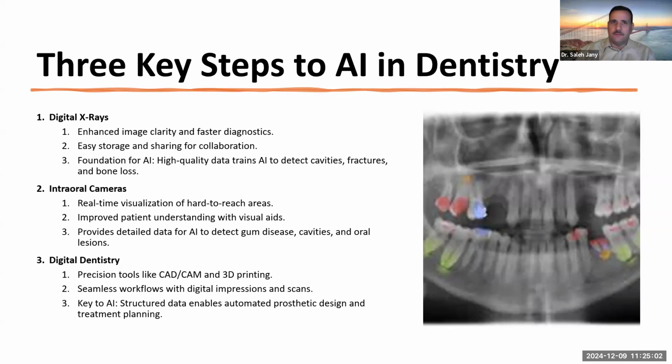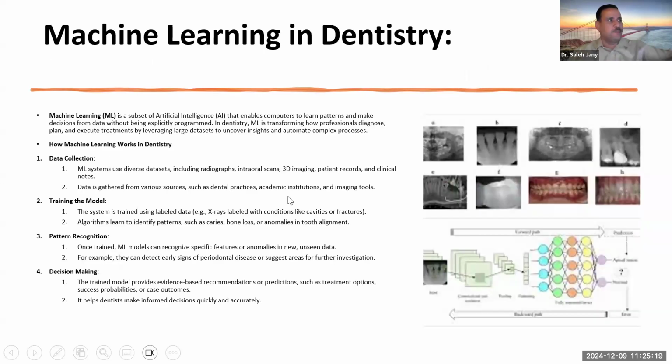If there's bone loss, you have less white. With thicker bone, we have more white. And the difference in shade will sometimes vary. If there is a difference in position, it's also different. But with AI and machine learning, this is a big deal. This is the new future.